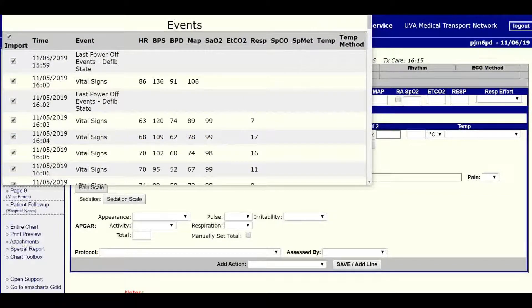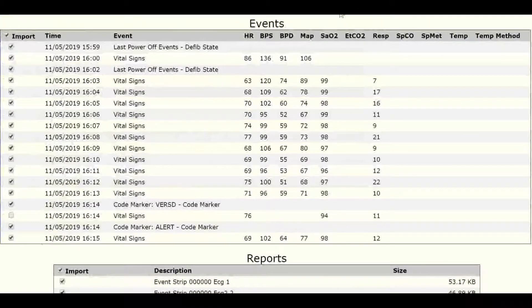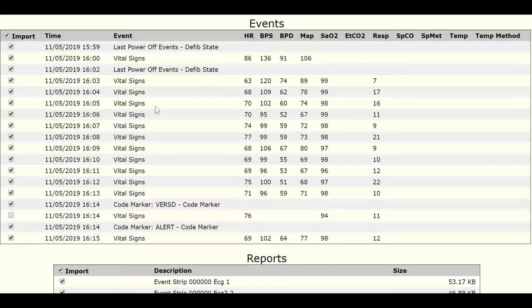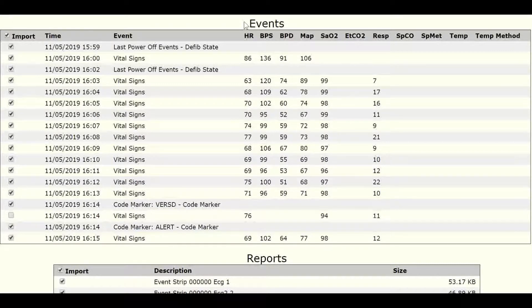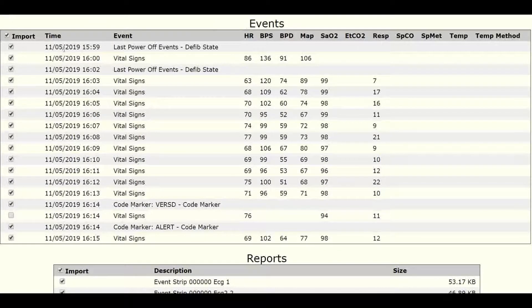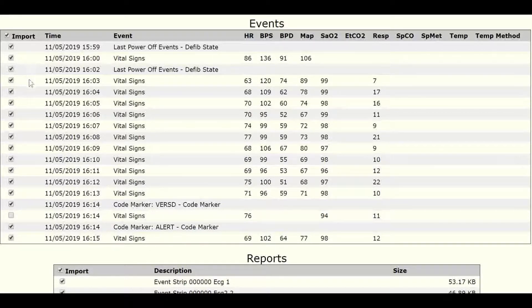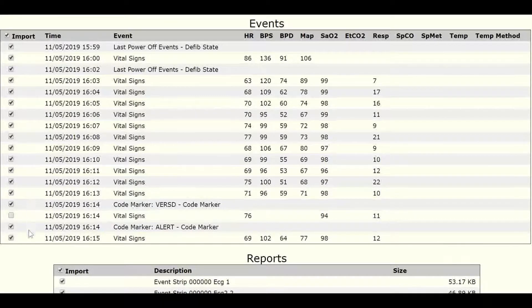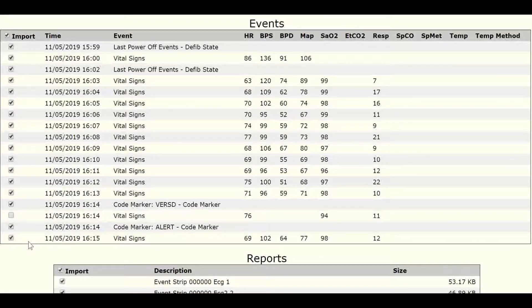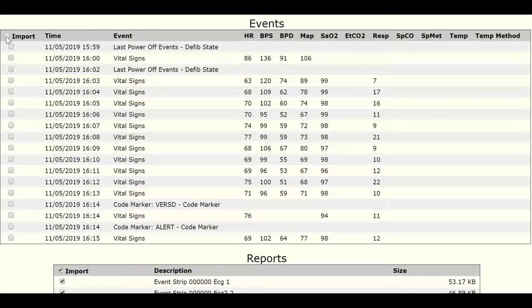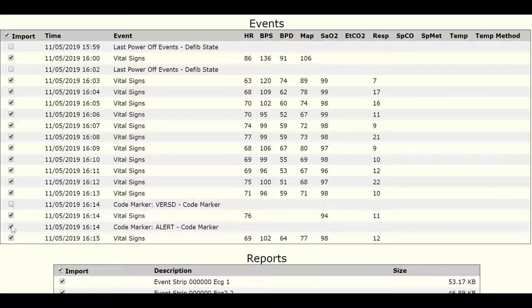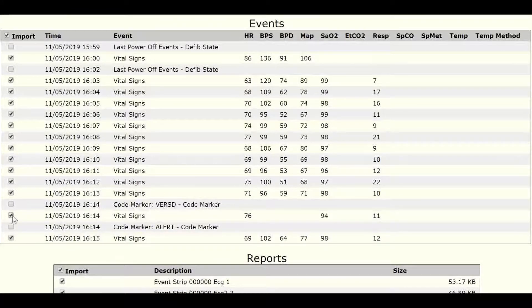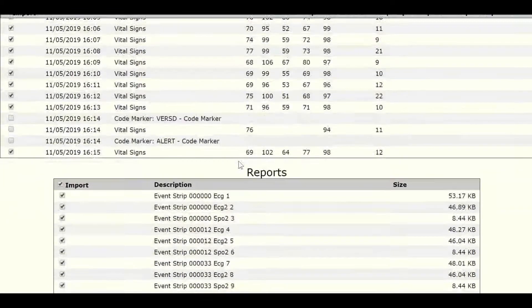Here you'll be presented with two blocks of information. The top is called Events, and has to do with anything you may have inputted into the monitor in terms of the vital signs, power on, power off, as well as any markers you may have done during the call. There's often a lot of these, and maybe some ones that you don't want, so you can selectively add or delete them for the import, and I recommend you do that.